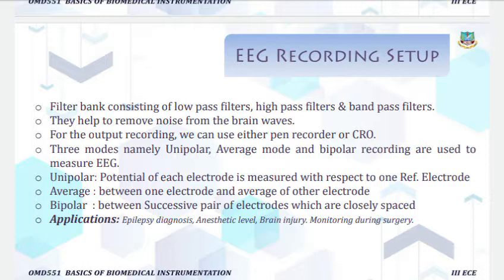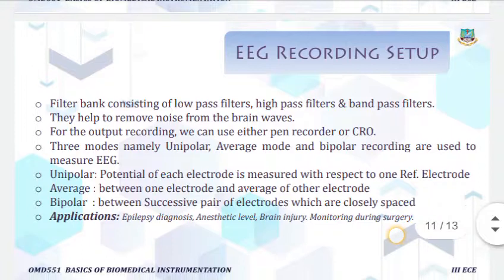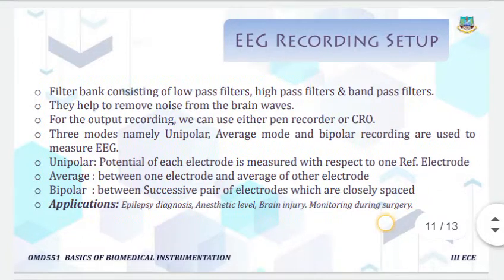Okay, so next, the application where we are using this EEG. It is mainly used for epilepsy diagnosis, anesthetic level, brain injury, and monitoring during surgery. These are the main applications where we use this EEG recording setup.